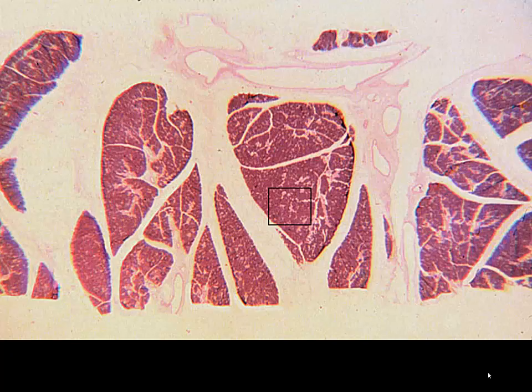The first that we will look at, as far as the major glands that we have, we're not looking at the minor salivary glands, but we're going to be looking at the major glands. And this is a section through the parotid gland. It is going to be lobed in nature and practically purely serous. And so even at this level, you can see all of the dark staining tissue.